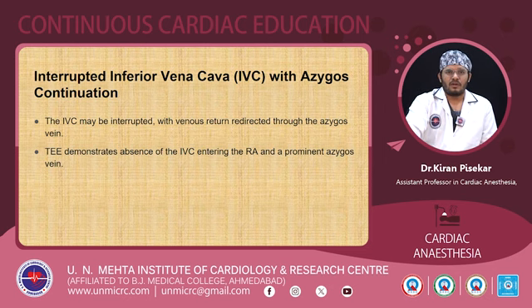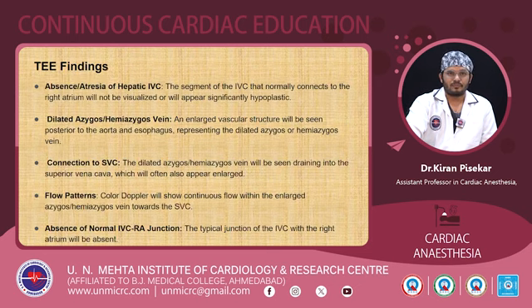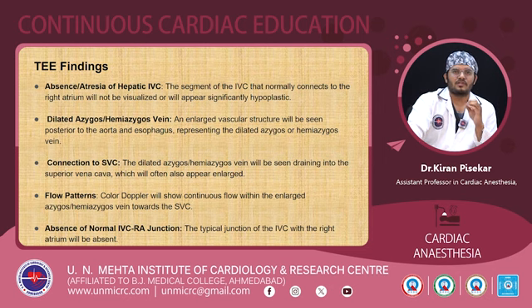By using TEE, we can demonstrate the absence of IVC entering into the RA with a prominent azygous vein. So TEE findings will be absence or atresia of the hepatic part of IVC, and a dilated azygous or hemiazygous vein, which is directly draining into the SVC. So the SVC will be dilated as well. And again, we can see the flow patterns. Color Doppler will show continuous flow with an enlarged azygous or hemiazygous vein, and there will be absence of the normal IVC-RA junction.